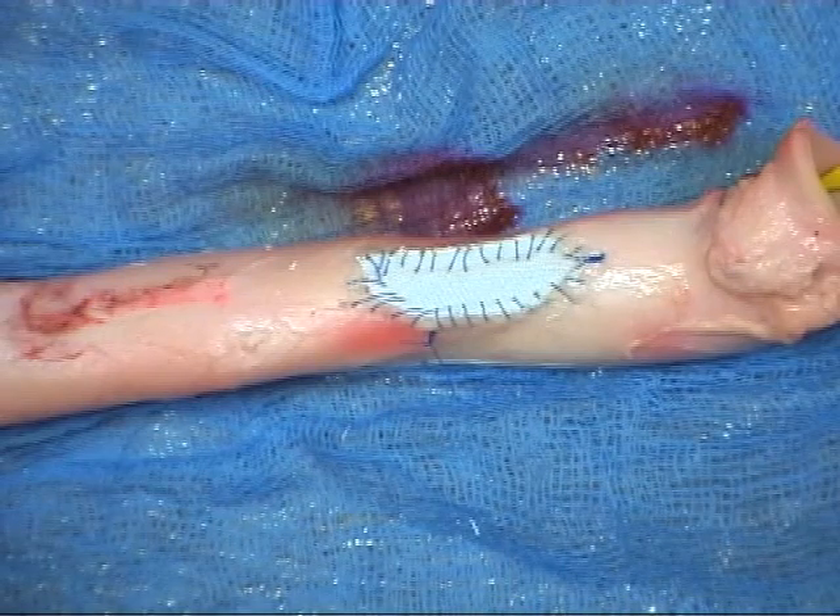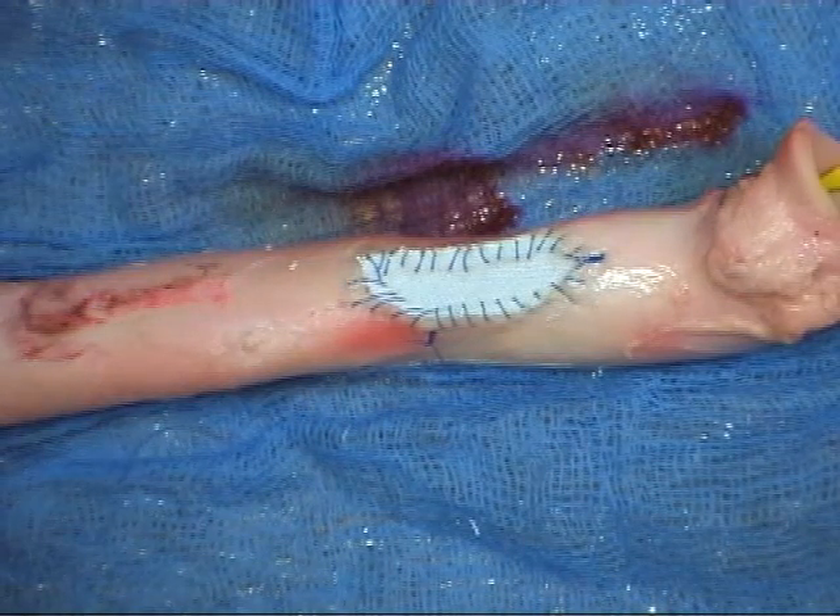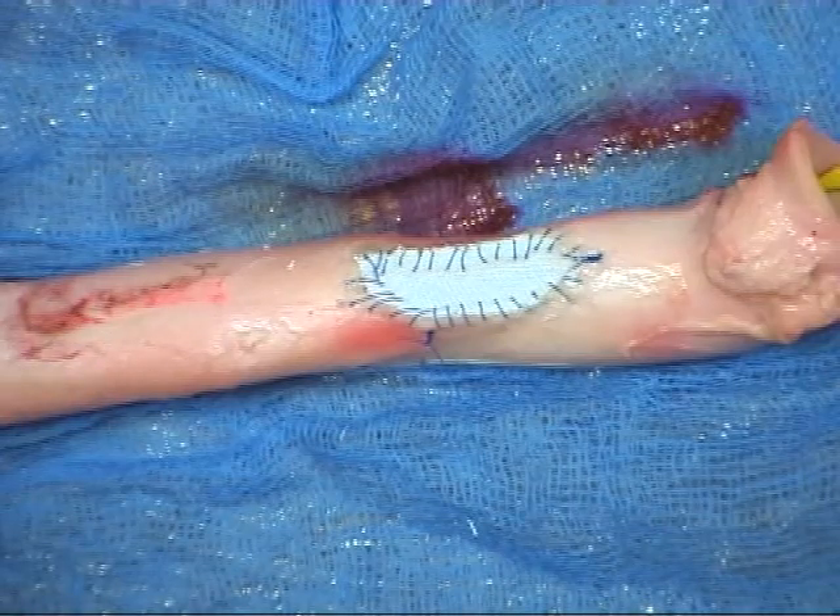A hand-tied knot is created with the two ends of suture, using six or seven throws for monofilament.